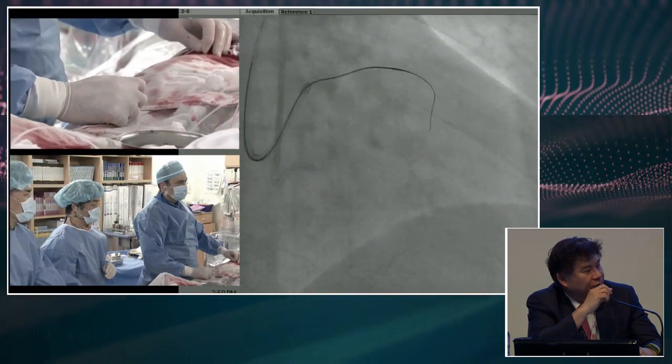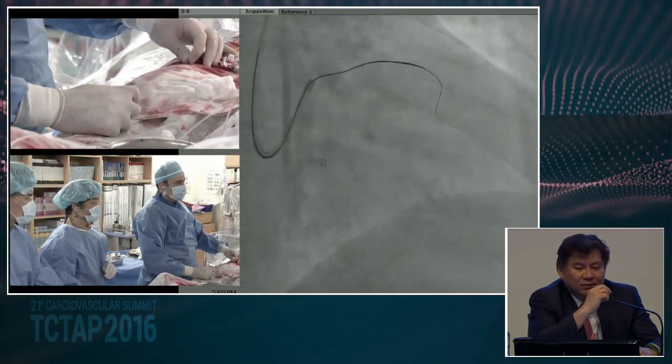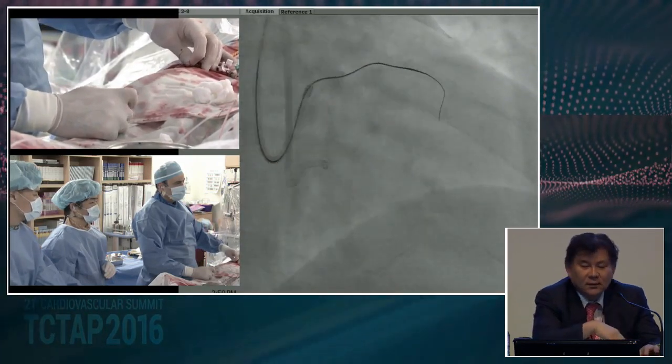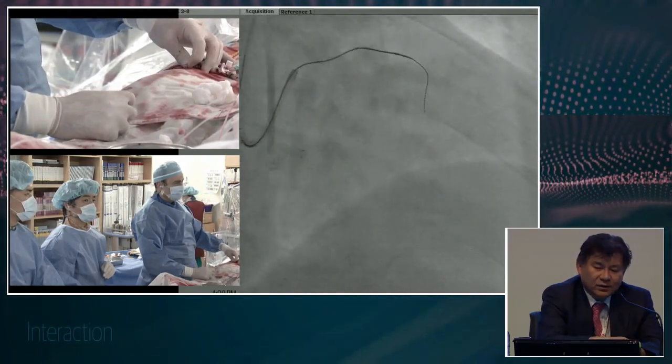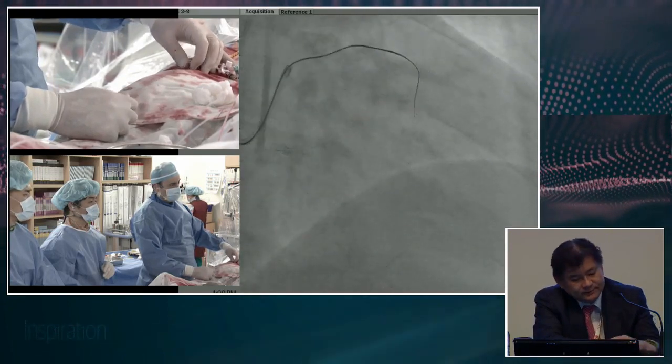And there's another second option. Just a simple redirection, I think it will not be so greatly difficult in this situation. For sure, the operator doesn't want to lose the wire. Another best option is the parallel wire using another soft wire.